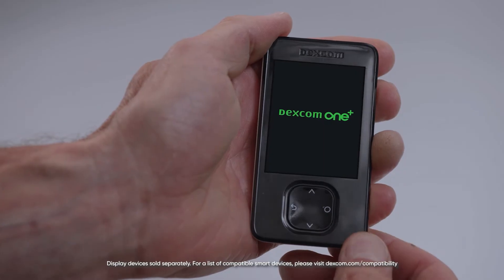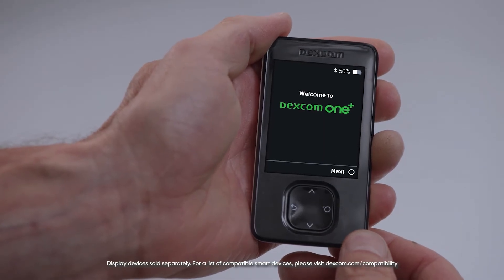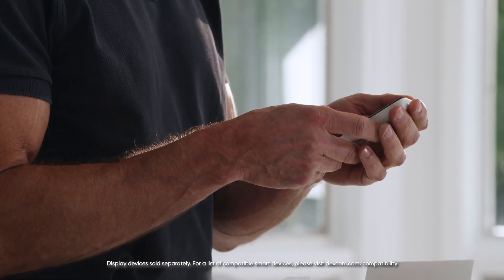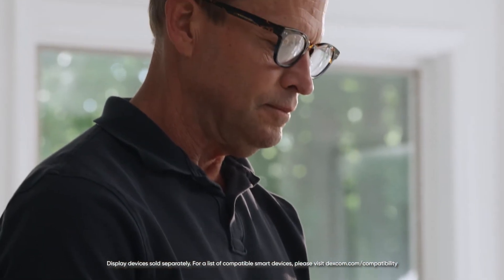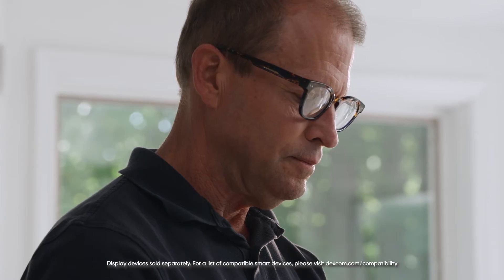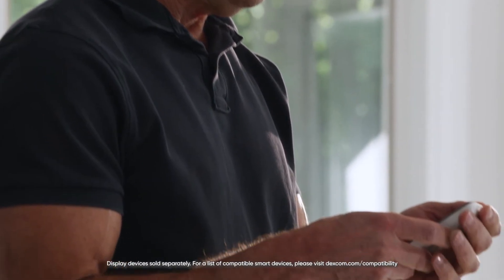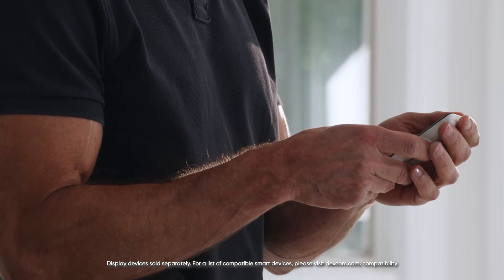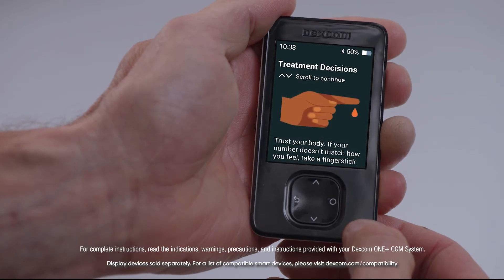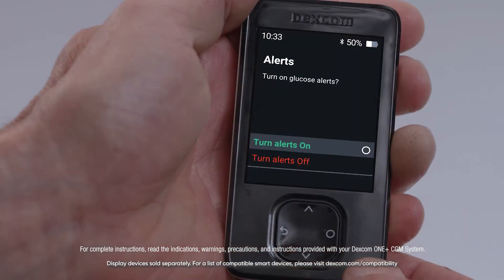The receiver walks you through the entire setup process step by step. Select next to continue. First, you will accept the Dexcom Terms of Use and Privacy Policy and set your date and time. The receiver will then display a series of educational screens so you can learn about your Dexcom One Plus. This in-receiver mini tutorial will teach you all about safety, trend arrows, and treatment decisions. Next, you will be given the option to turn alerts on or off.